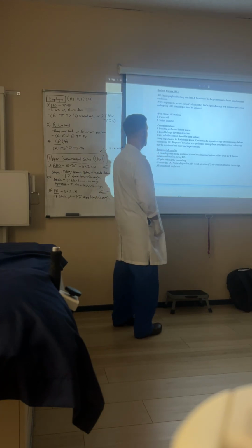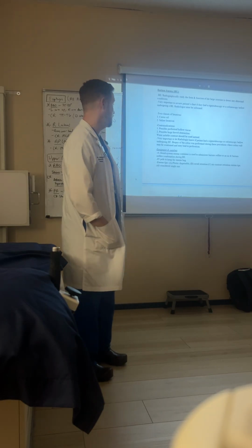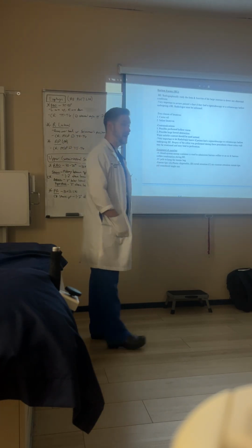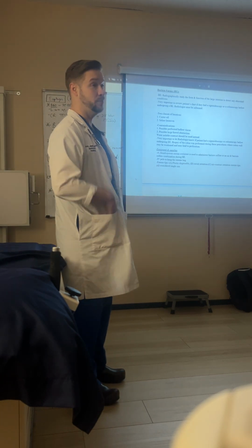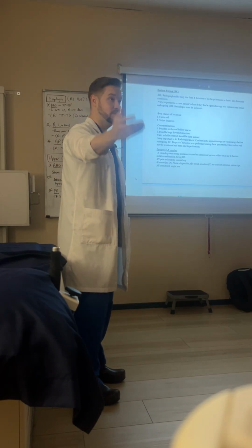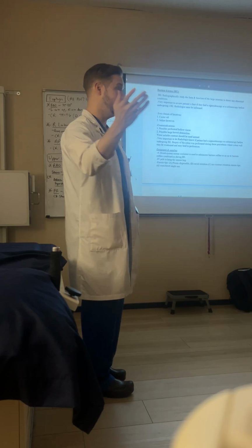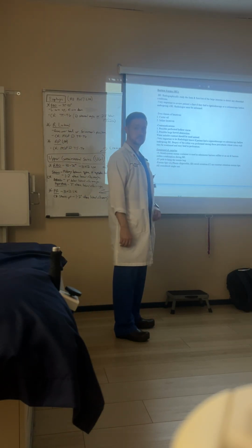Contraindications for barium enema. Perforation. Obviously, we don't want to use barium anytime that there's a risk of some kind of perforation of the GI tract. Possible large bowel obstruction. If a patient has a large bowel obstruction, we definitely don't want to put barium in there to make the issue worse. Their bowel would suck up all the water and they would be left with even more of an obstruction.